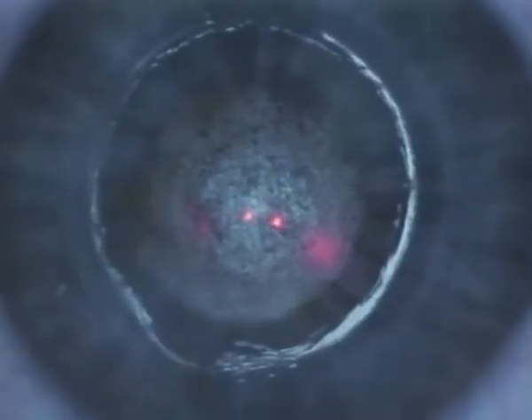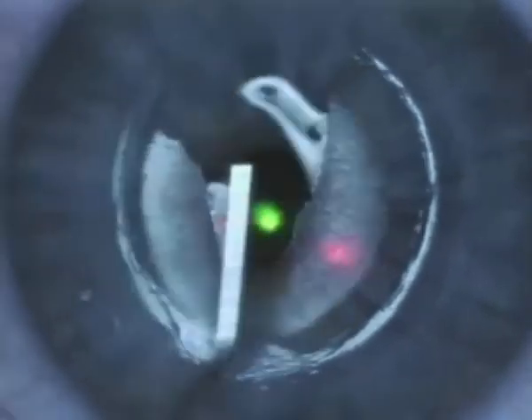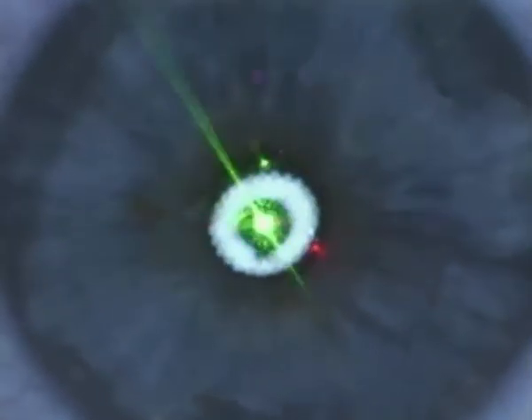We now place cooled BSS onto the cornea. We're trying to wash out all of the inflammatory components and inflammatory mediators that were released by breaking up cells during the ablation.